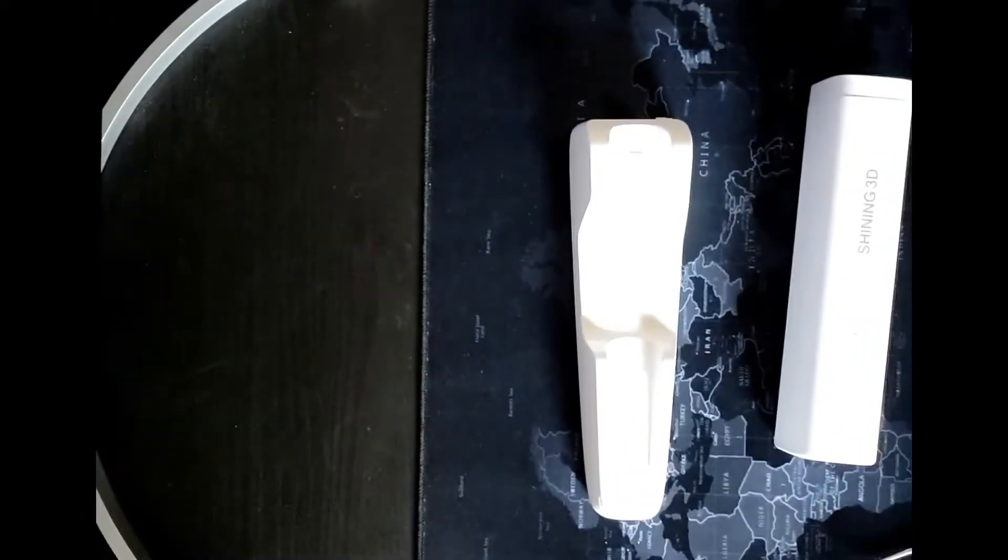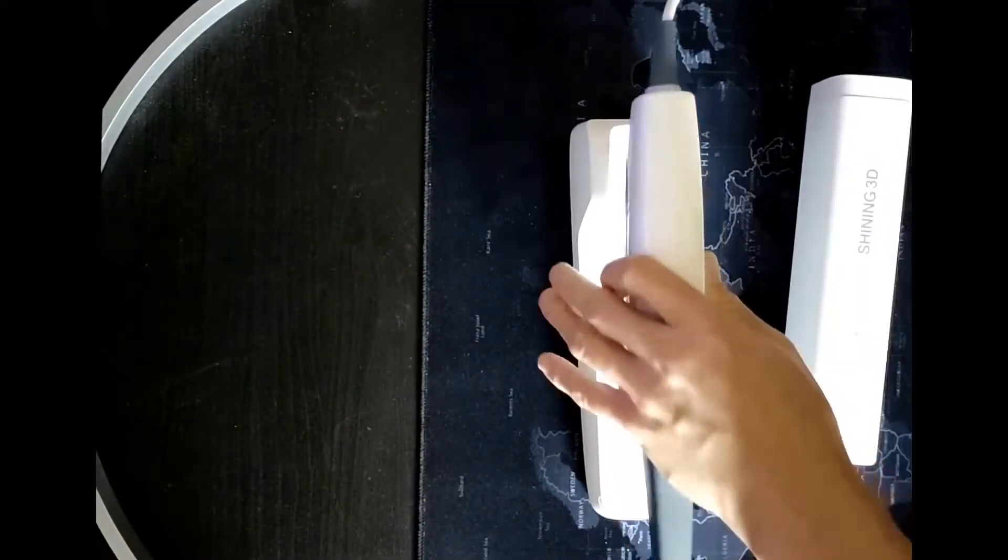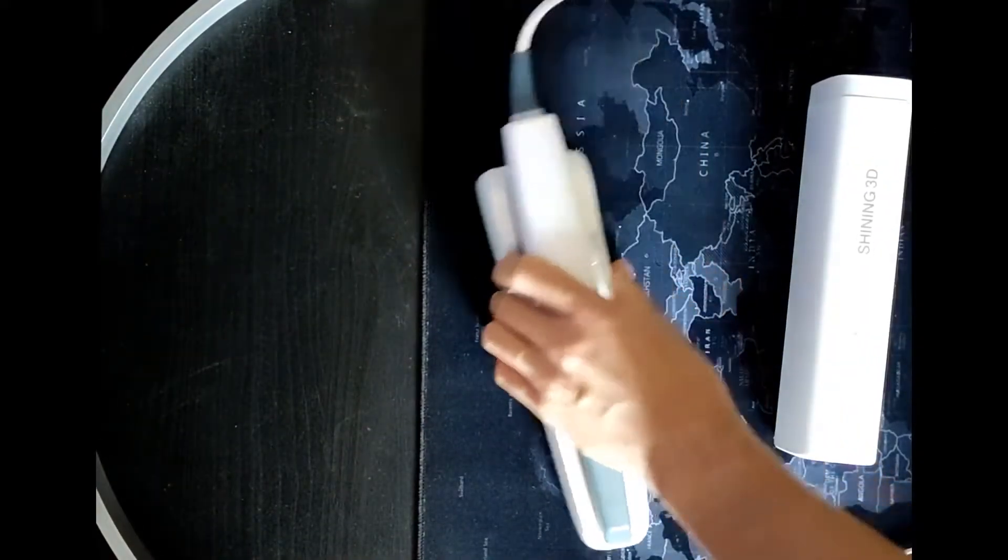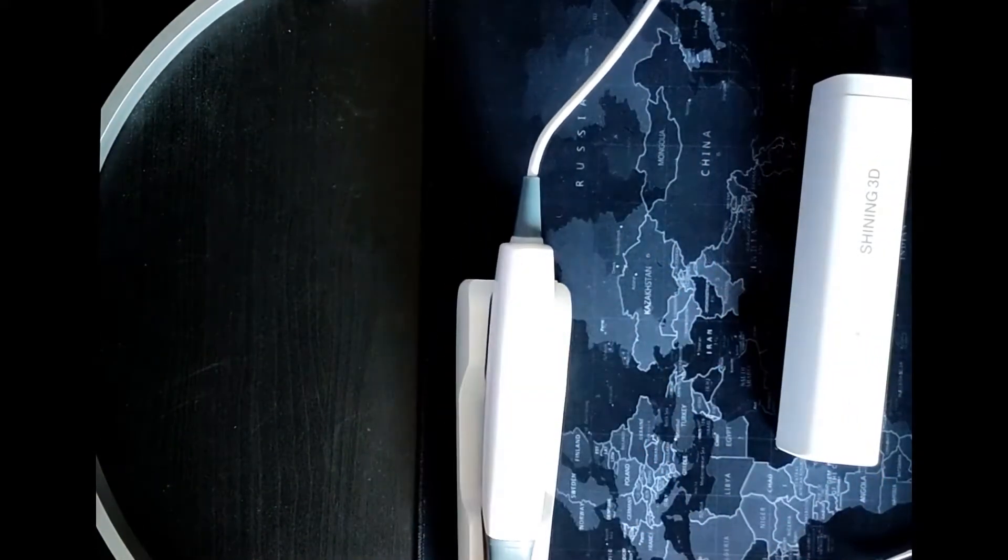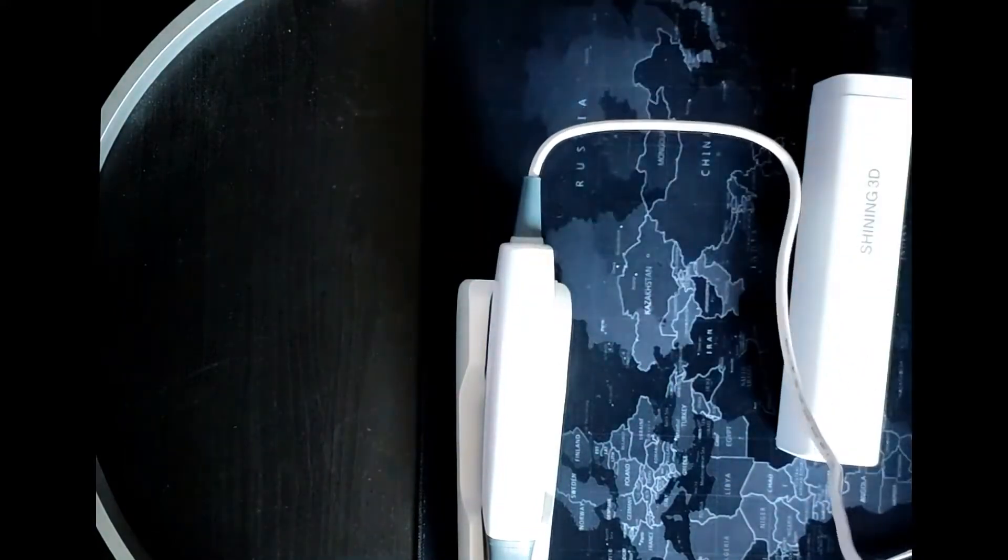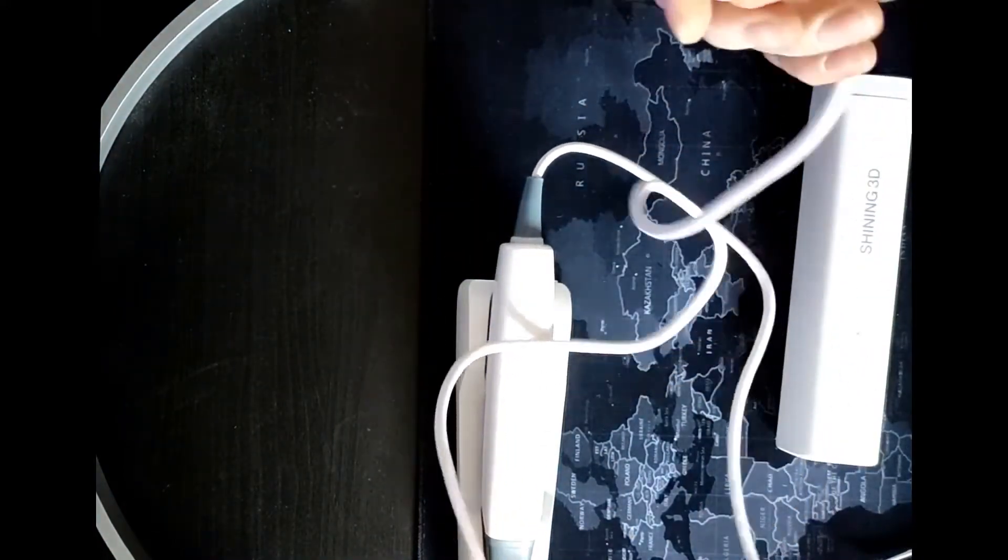Ok, now we can connect the cord of the device to the scanner base.